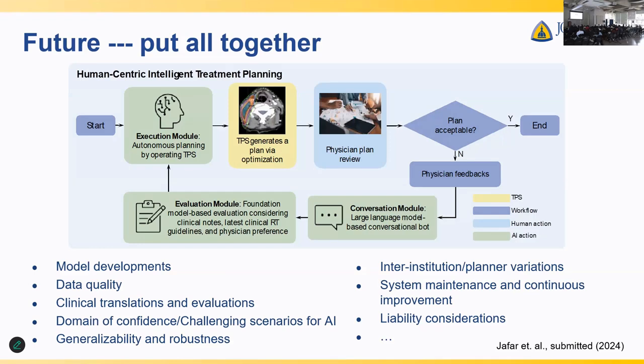The last question is TCP and NTCP. Those are the tumor control probability and the normal tissue complication probability. Those are established math models to predict treatment outcomes. Yes, we can easily include them in the objective functions as we train the AI models. Great, thank you.